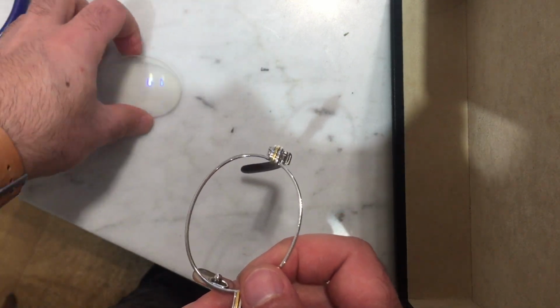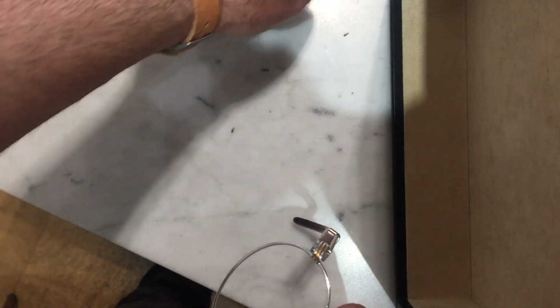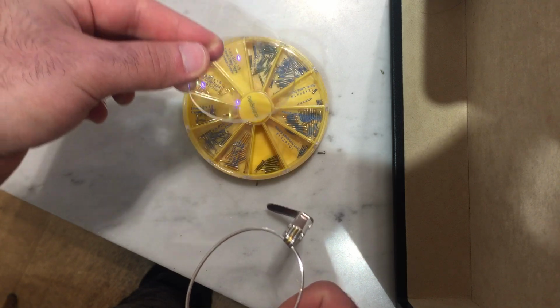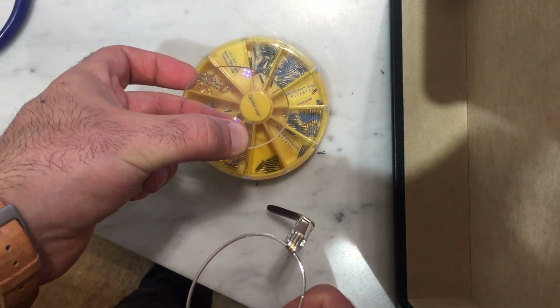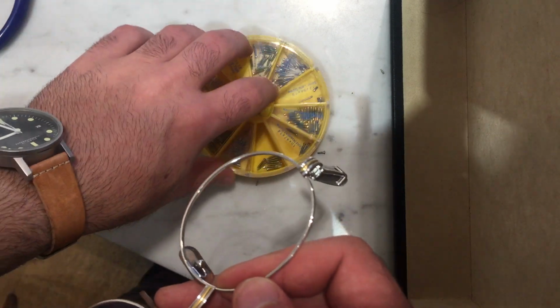What I was doing there was what I've showed you before about the lens distortion. This is how you can find which side of a progressive lens you have. Just look at where there's more distortion. Nine out of 10 times that's your reading area. So let's set it down, reading down, that way you know what's up.